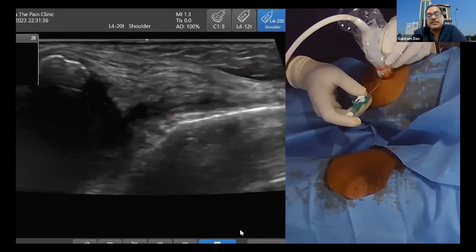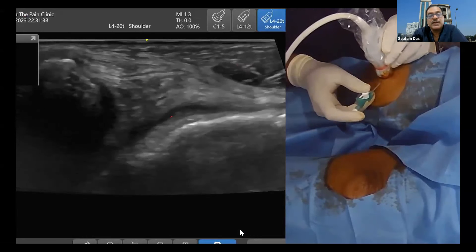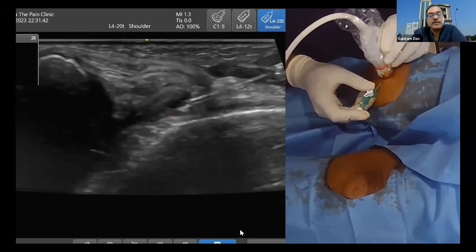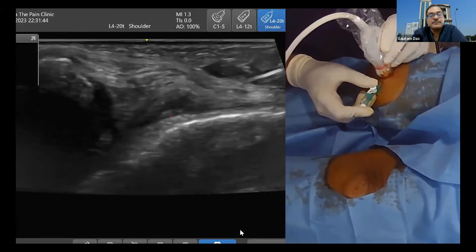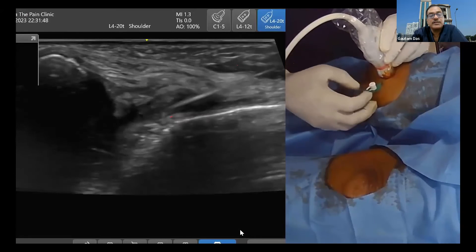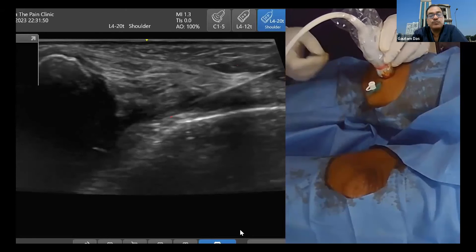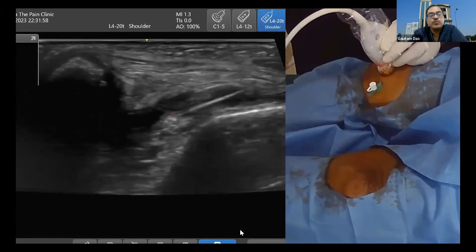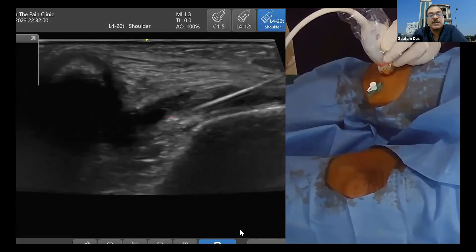The needle is going from medial to lateral side. Now we are entering into the synovial sac. You have reached the target. Even if the patient has no effusion or minimal effusion, you will still be able to do this and see the synovial sac nicely.